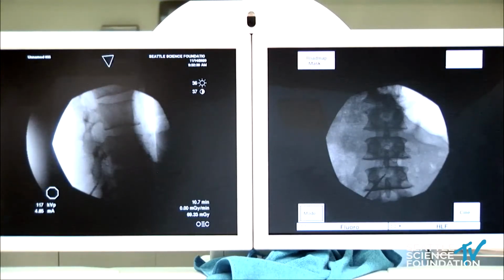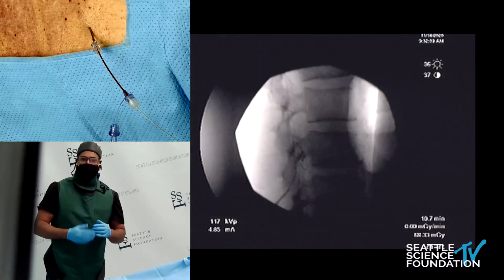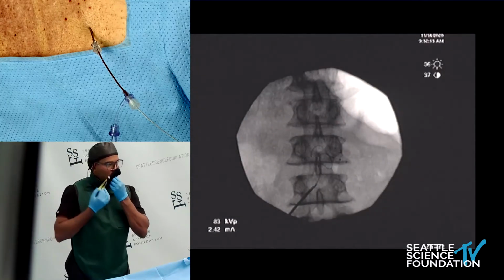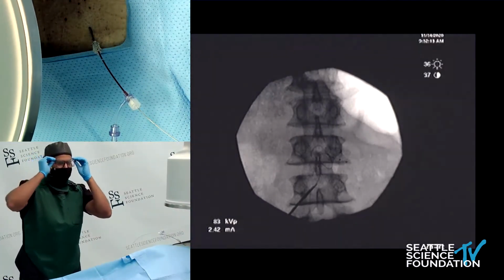And this is actually great, because you can see where the leads now actually have some depth, and that last loop I made is actually a little bit more posterior than the initial loop. So there's actually quite a bit of distance, and we can come back to an AP here. All right, so that's basically the DRG trial with the lead placed there.